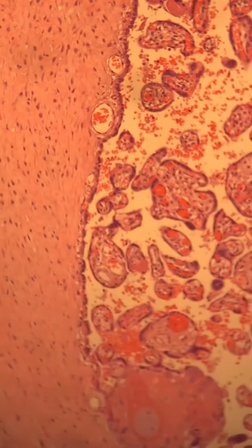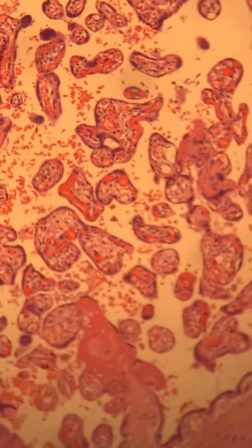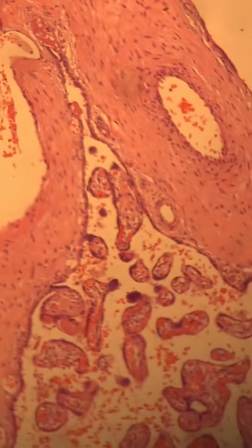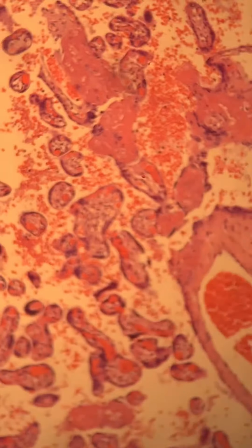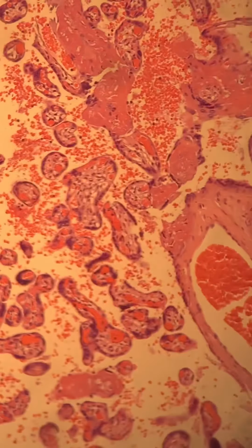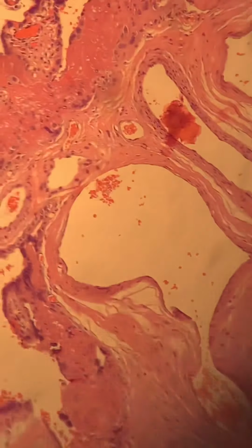So we're looking at the placental body tissue from twin A, and this is normal-looking third trimester chorionic villi, very normal. So twin A, well, there's some slight villus fibrosis, but not bad. As we continue to peruse around, good blood vessels, and actually mature chorionic villi, if I can keep it in focus. Very nice chorionic villi. Actually, this is not bad right here.